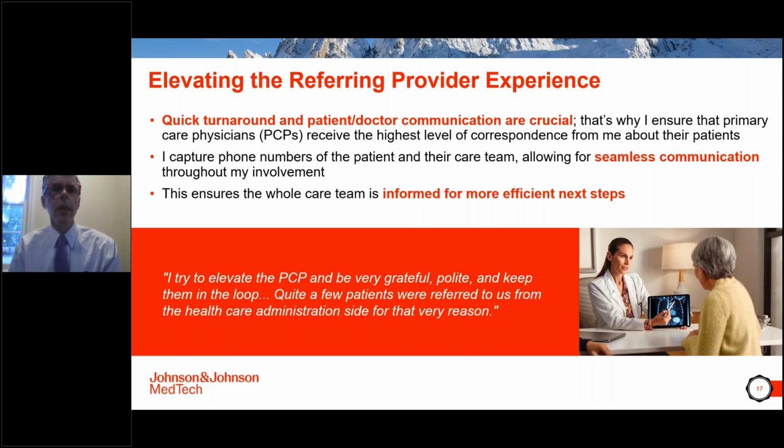And I've seen in other institutions where all of the bones of the system are strong. Everything is being done right. The technology is in place. There's excellent infrastructure. There's a navigator. Pathology is right, and yet the communication that exists between the interventional pulmonologist and the referral base is broken somehow, or maybe it's confused. And that can happen a lot when there are multiple interventional pulmonologists doing the same procedure. It can diffuse the experience in such a way that it makes it difficult to establish muscle memory in those referrals. We don't really have that here in Savannah, since I'm the one who does most all of the robotic procedures, the bronchoscopy procedures. Everybody knows who to send the patient to and how to get in touch with me.